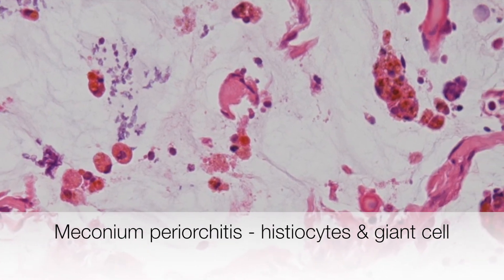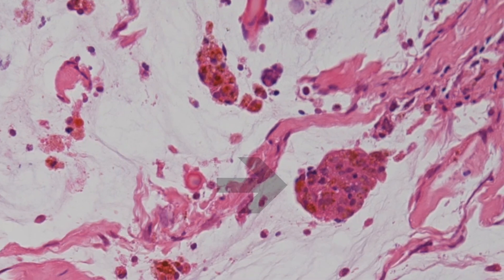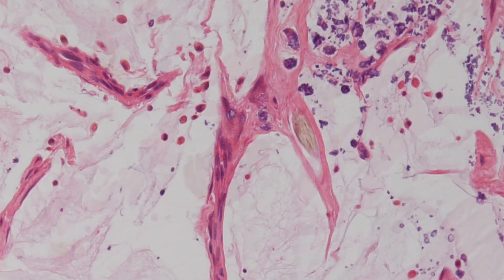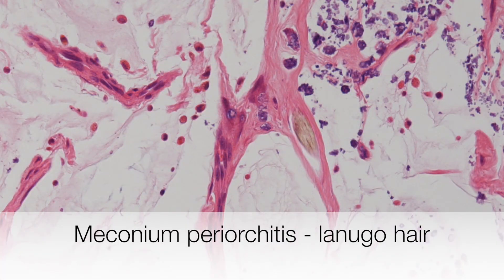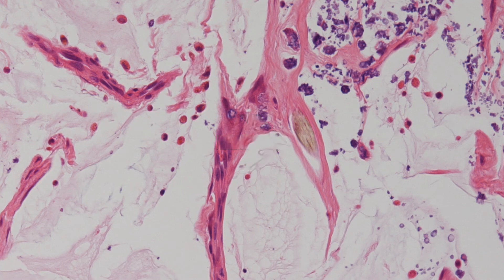Here are some pigment-laden histocytes — the pigment may be bile. And here is a foreign body type giant cell. So how do we know that this appearance is all caused by meconium? The clue is this hair shaft that is embedded in fibrous tissue, and this is a fragment of lanugo hair from the foetus. Amniotic fluid is ingested in utero together with the lanugo hairs that pass through the gastrointestinal tract, eventually forming meconium.